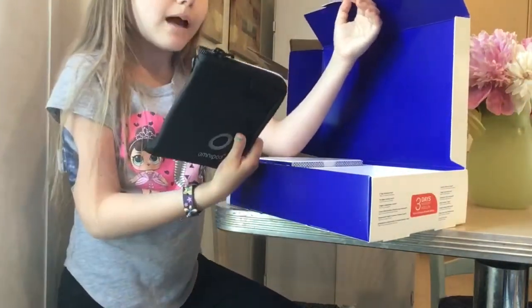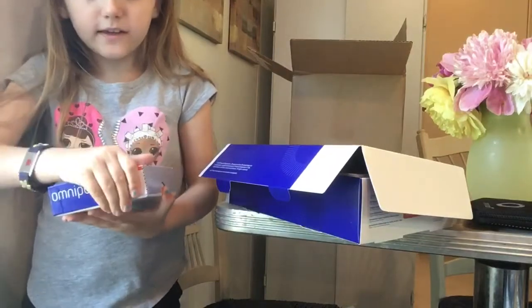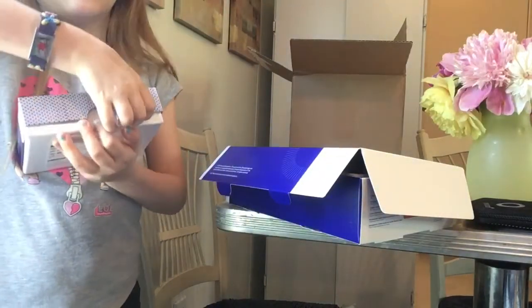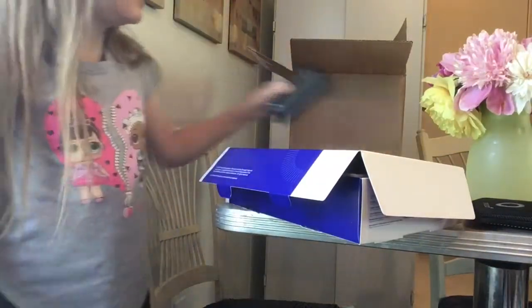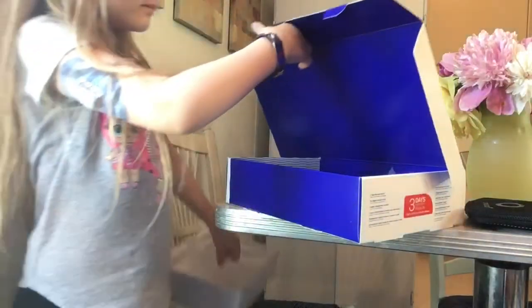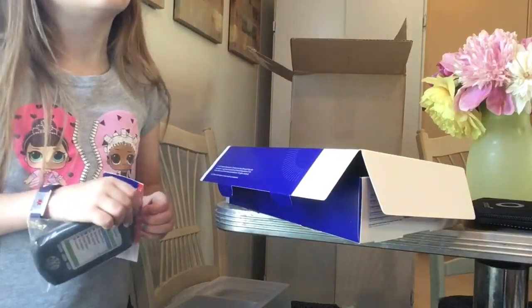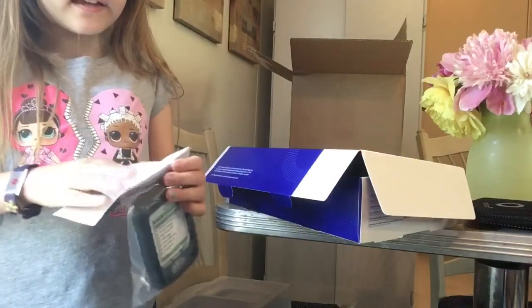Oh cool, I have a case to put it in! I don't even really know much about this. Here's a black case, and I might decorate it if I can get a new case. It's squishy!